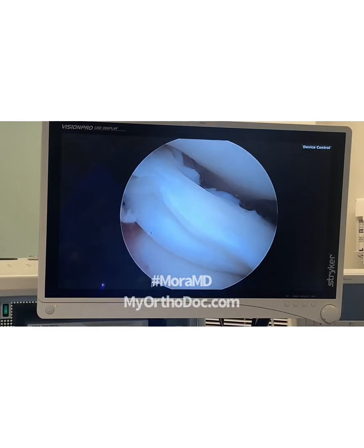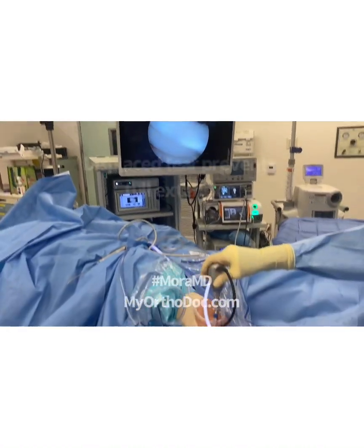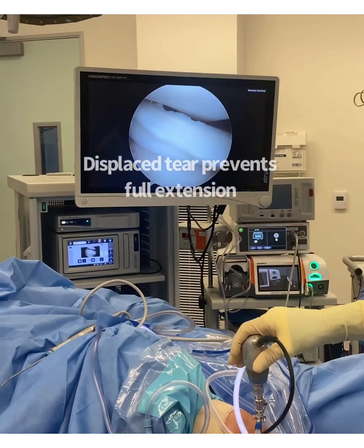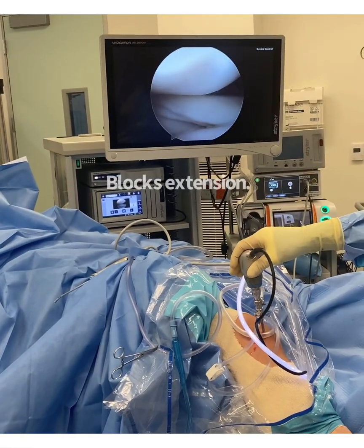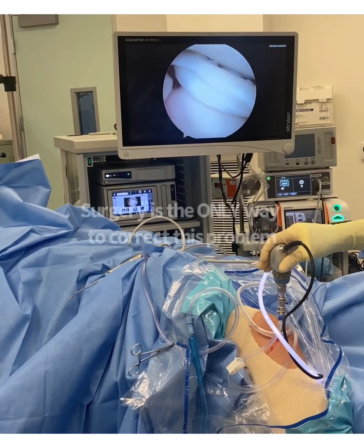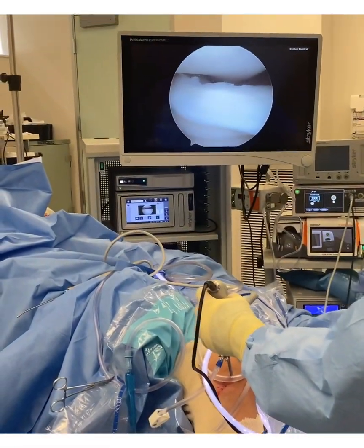So once it's in the notch, like the way it is right there, come over here and look down. See what happens as the patient tries to extend the knee — the meniscus blocks extension. Can you see the monitor up there? See how the meniscus is blocking extension?